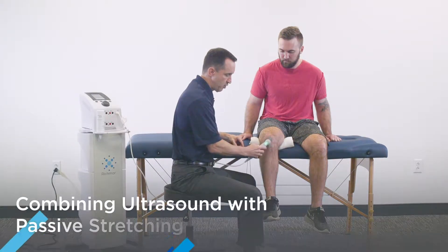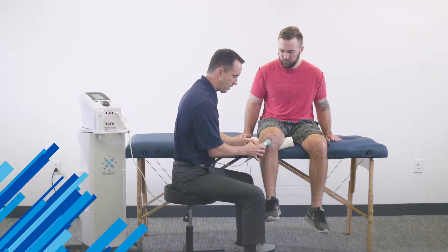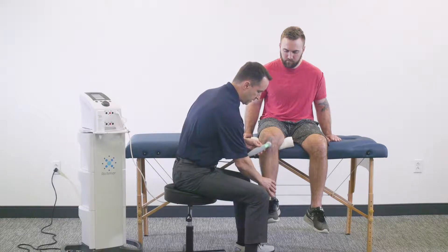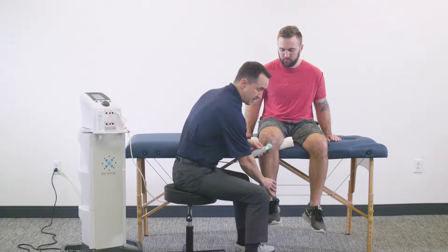If we fast forward toward the end of the treatment, I would simply continue sonating with the applicator and then apply a nice gentle stretch at the ankle to get a nice static stretch of the patella tendon.